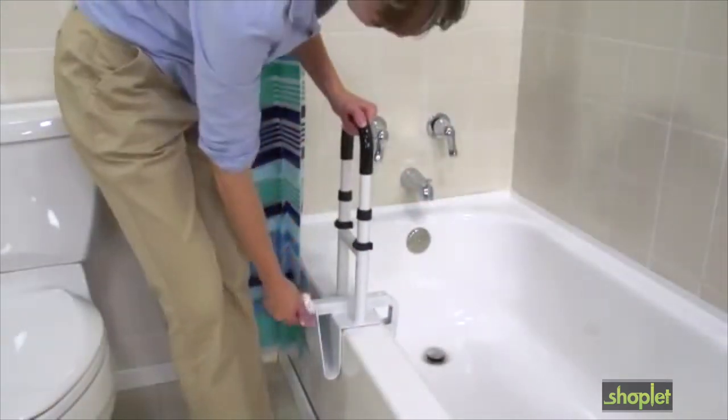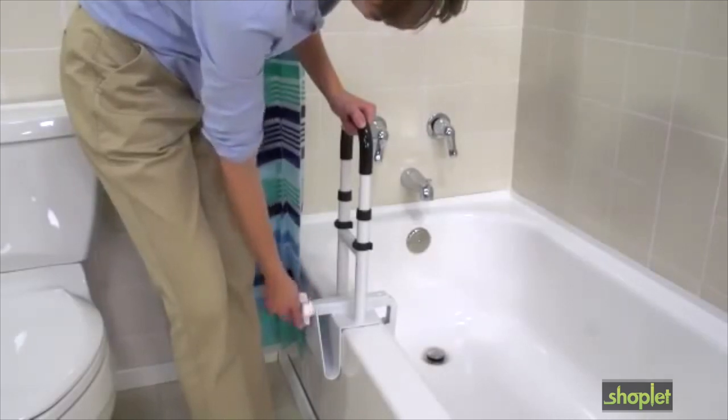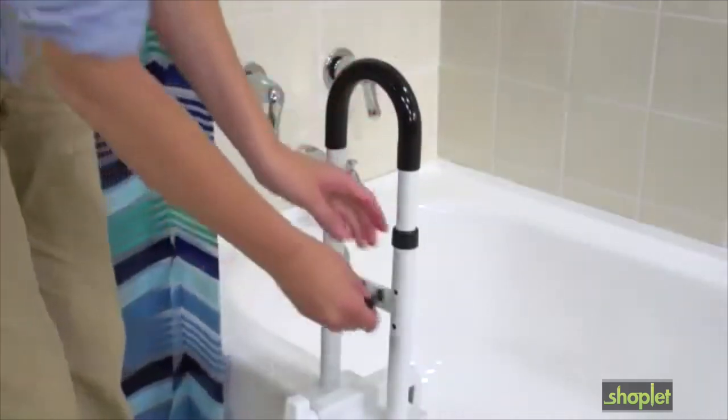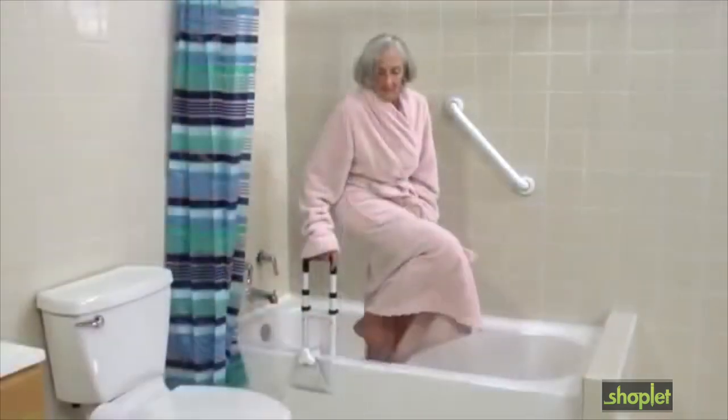Non-marring rubber pads tighten securely to all bathtub contact points while providing scratch-proof protection. The rail height can be adjusted from 14 inches to 17 inches to accommodate most users, so it's great for kids too.